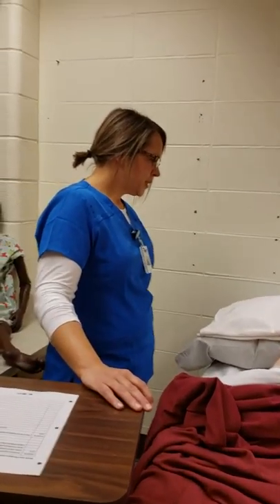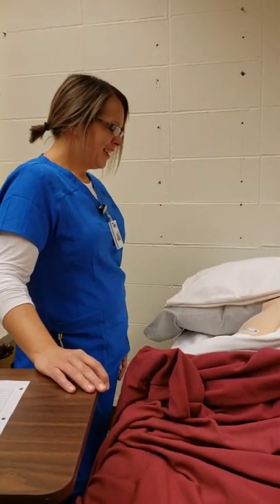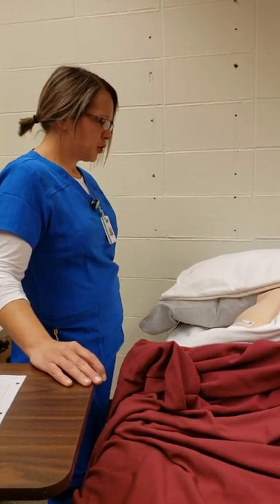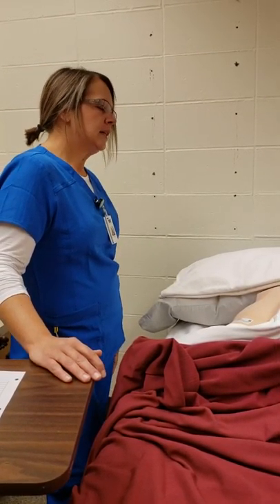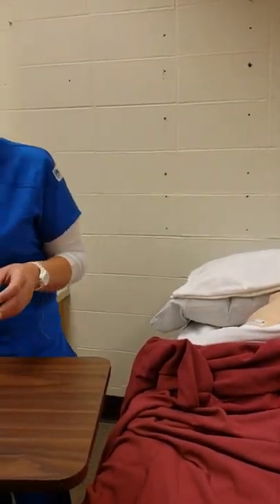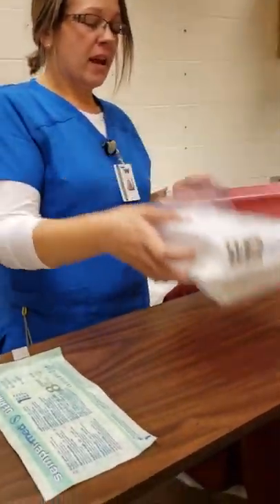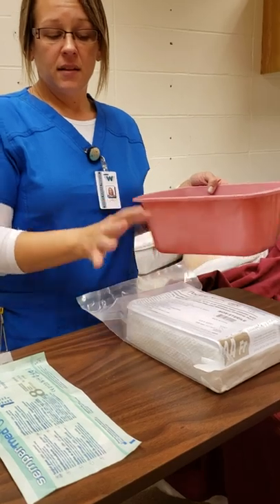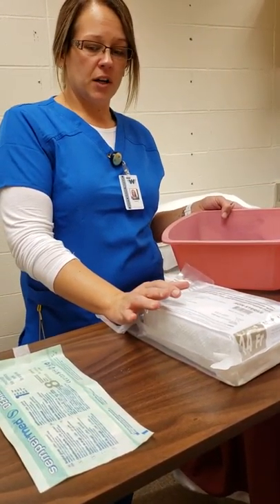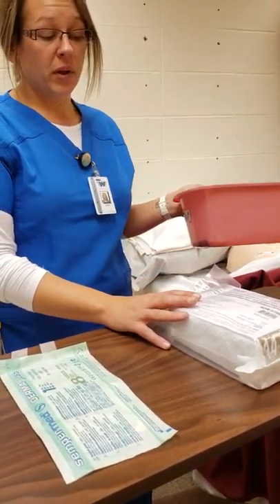You're going to be having abdominal surgery today. So we're going to do an indwelling catheter, and the doctor has already explained this procedure to you — just double-checking. I'm going to get out my sterile gloves and the catheter kit that has been provided — the correct size for my patient, which the doctor ordered: a 14 French indwelling catheter.